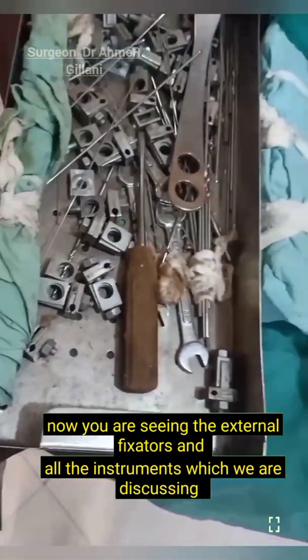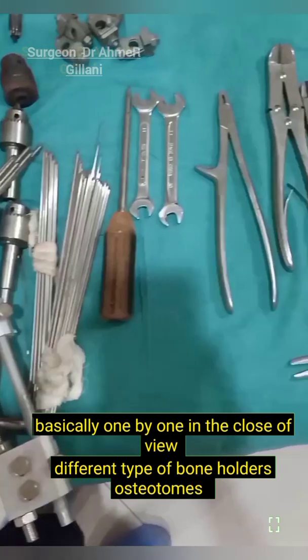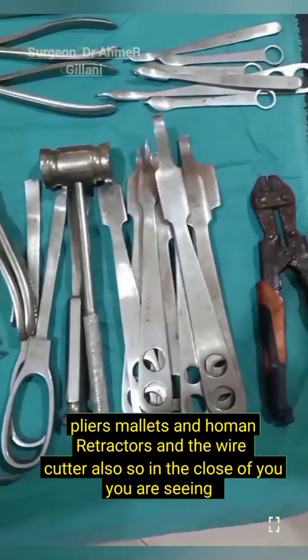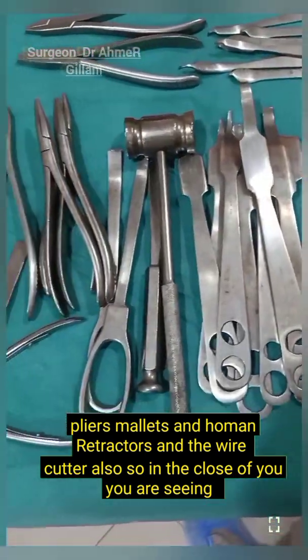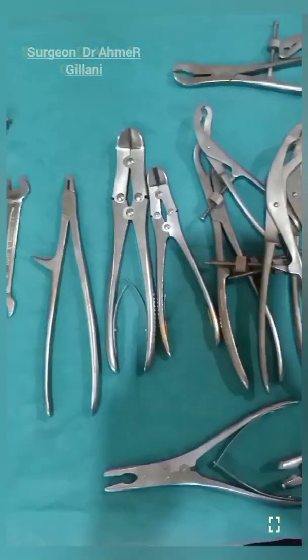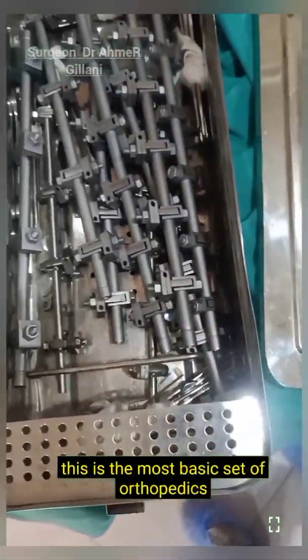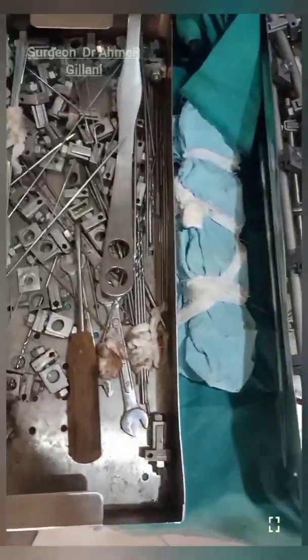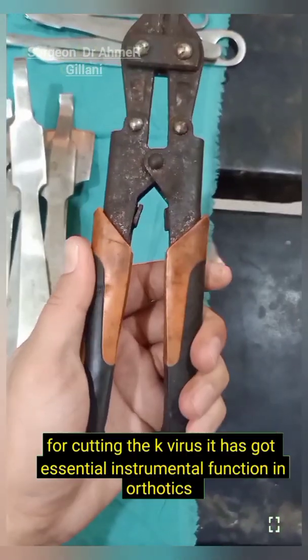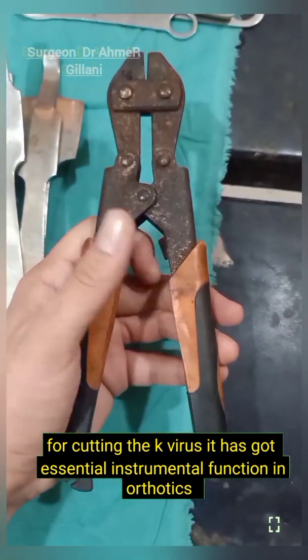Now you are seeing the external fixators and all the instruments discussed one by one in close view — different types of bone holders, osteotomes, pliers, mallets, Homans retractors, and wire cutters. This is the most basic set of orthopedics. You are seeing the wire cutter on your screen, used for cutting K-wires. It has an essential functional role in orthopedics.